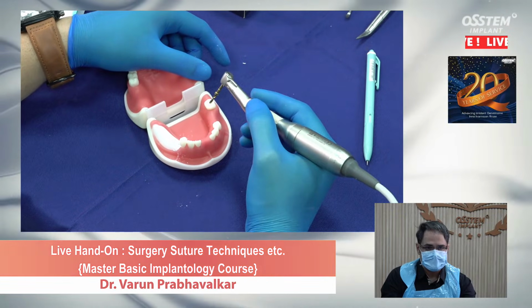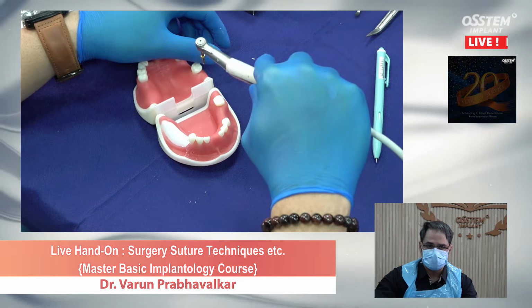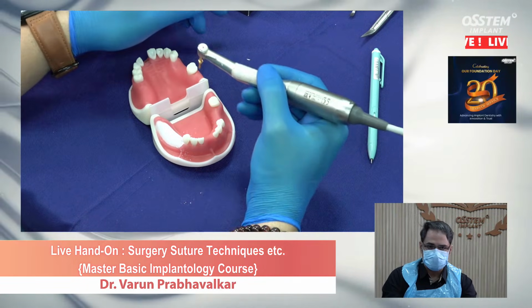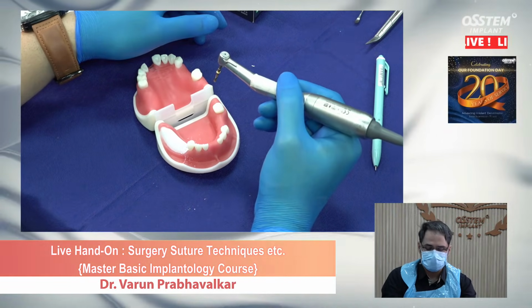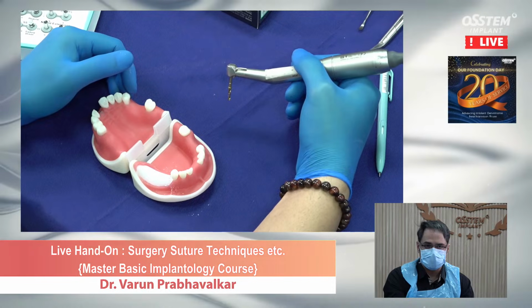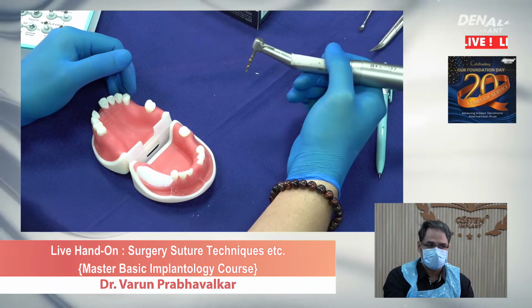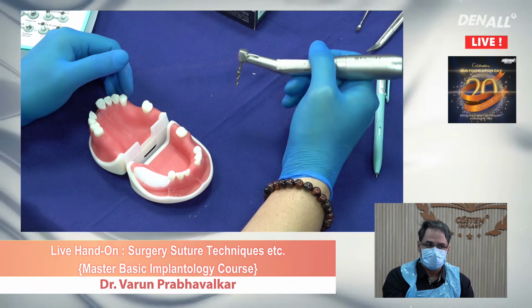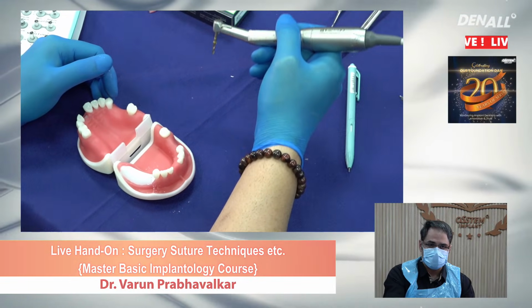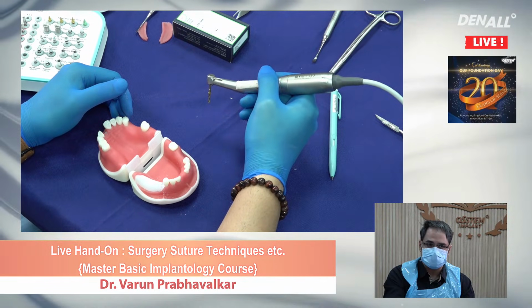They are horizontal. While doing the osteotomy in the implant, your strokes are always going to be only vertical, one in, one out. That's all it is going to be, and that's why what should be stable is your hand while doing the vertical osteotomy. If your hand moves in angulated manner, instead of going vertically down, you're going to have orientation like this. This is known as ping pong hand, and you're going to have a wrong angulation for your implant placement. Okay, make sure your hand moves vertically from your elbow downwards. Okay, and that way you create an absolute vertical control.